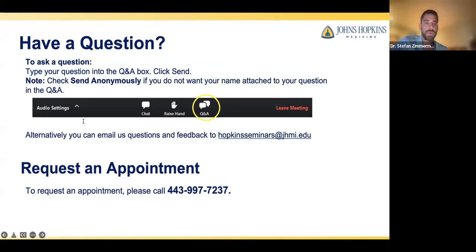Okay, what are the risks of calcium scoring tests and any other imaging tests? So the risk of the calcium score test is the radiation. And so the calcium score radiation is low. I think in general, our scanner technology has gotten really good. And so in general, all the manufacturers of these scanners have been working really hard to reduce the radiation doses, and they've come down a lot from the early days.